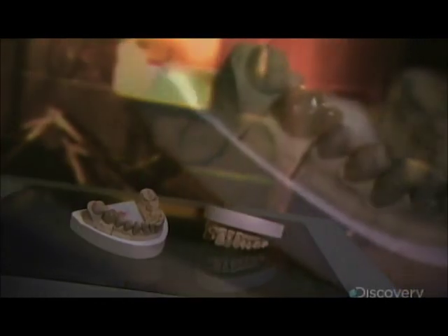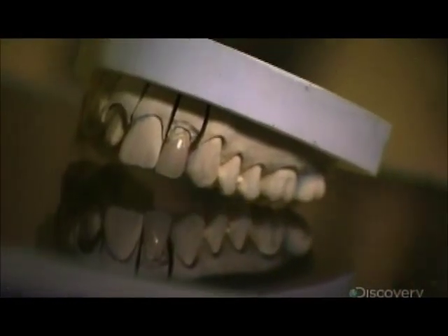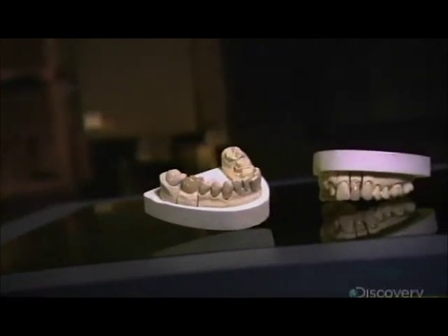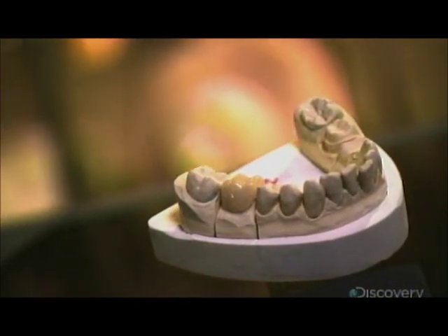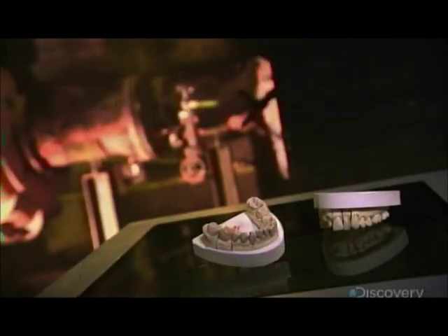Digital technology is revolutionizing dental treatment. 3D cameras and computers can now be used to produce crowns and other prosthetic restorations on-site, eliminating the need to send the work to an outside lab. For the patient, it means one appointment instead of two, and less time in the dentist's chair.